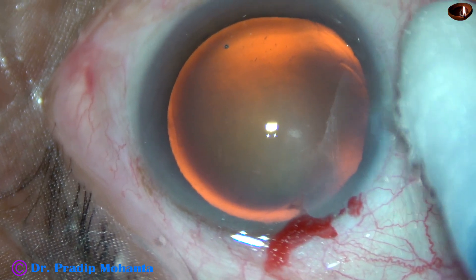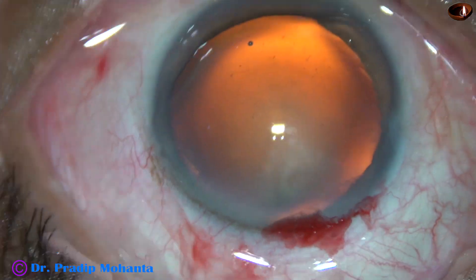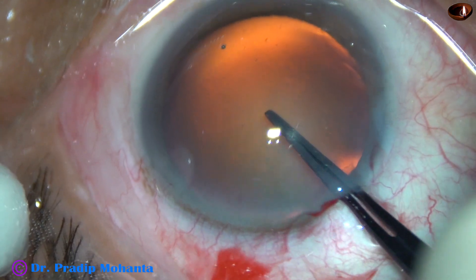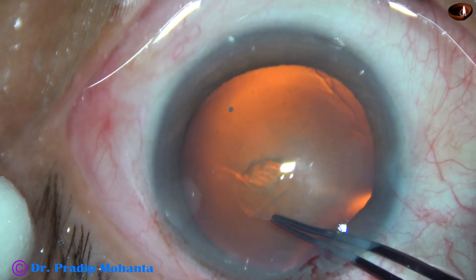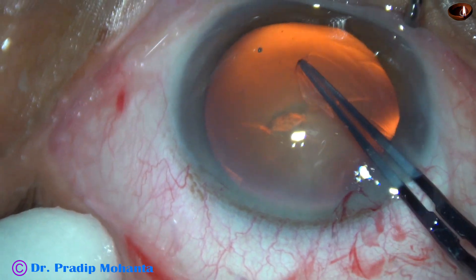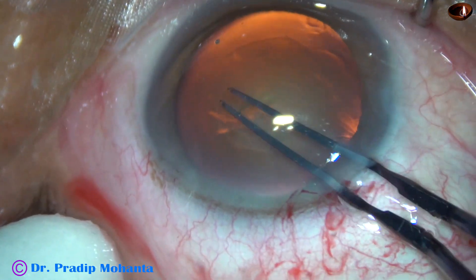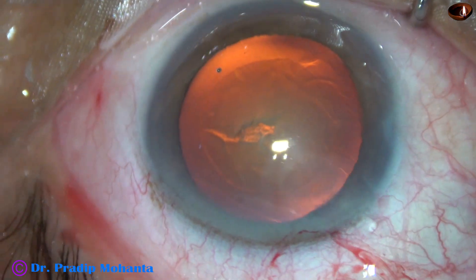Now a side port is made on the left side of the main incision, about 2.5 clock hours away. Capsulorhexis is being done with this instrument — this is a Utrata forceps. The anterior capsule is torn, a capsular tag is raised, and this capsular tag is guided anti-clockwise, remaining at a certain distance away from the margin of the dilated pupil. And thus a fairly round, optimum-sized rhexis is achieved.